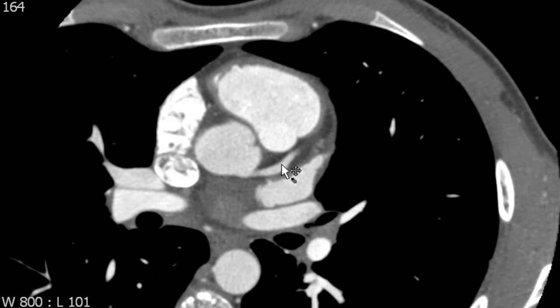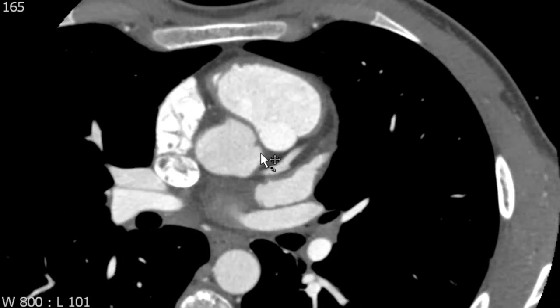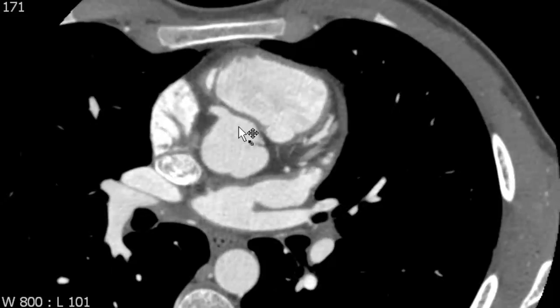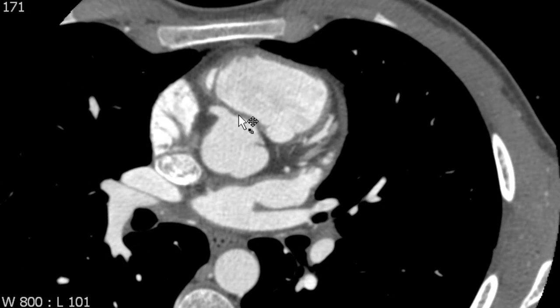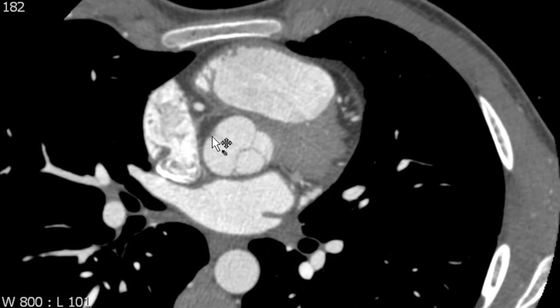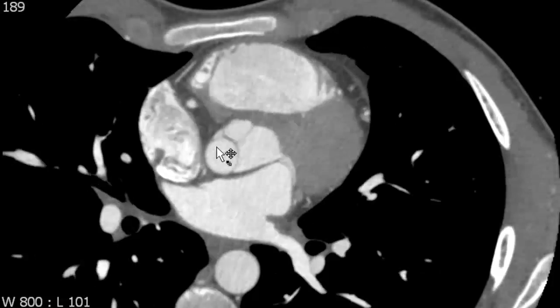If we look at the origin of the left main coronary artery we can see that it comes out of this sinus of Valsalva — so this is the left sinus of Valsalva. And if we look at the origin of the right coronary artery we can see that it comes out of this sinus of Valsalva — so that is the right sinus of Valsalva. The final sinus that has no coronary artery arising from it is the non-coronary or posterior cusp, or sinus of Valsalva.